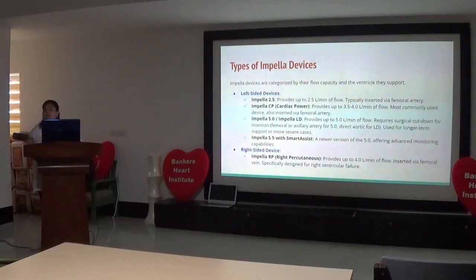We are helping in systemic perfusion with IABP, but in comparison to IABP, Impella is much better because the LV does not have to work. It does not have to pump, so it has a time of recovery. The decrease in myocardial oxygen demand is more with Impella, because the entire blood is being pumped from the LV to the ascending aorta.